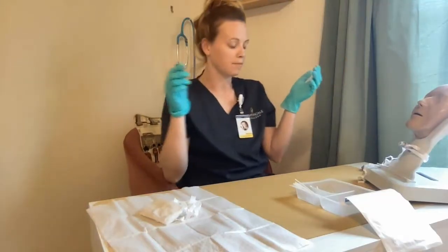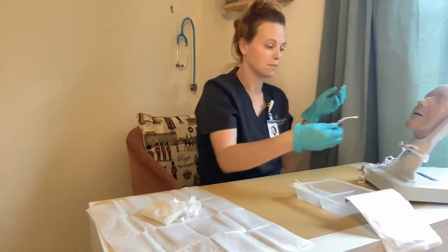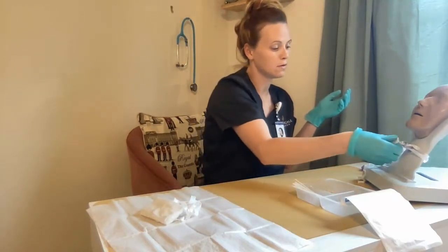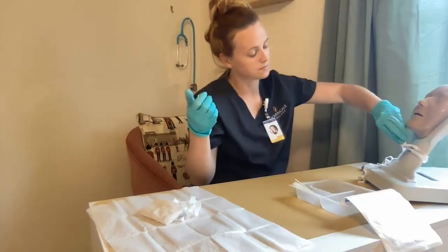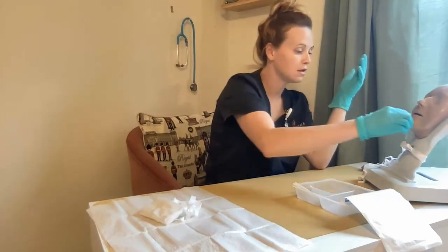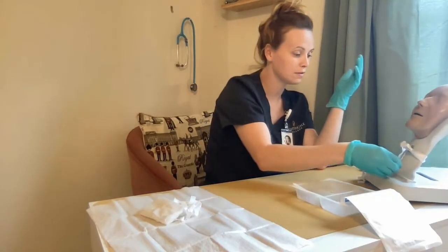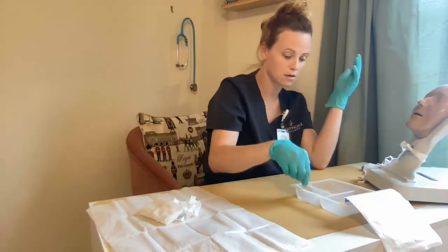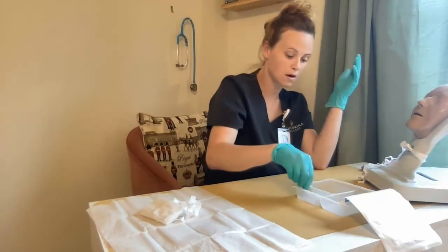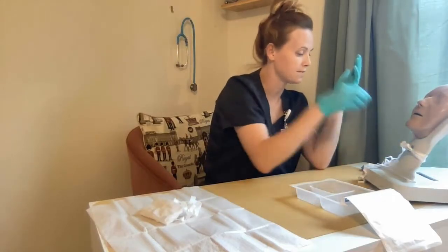I'm then going to get my cotton applicators and place them in the saline on the other side. I want to then place my intercannula back in again, ensuring that it goes in with the same curvature, and lock it in place. Then I'll get my cotton applicators and clean around the stoma, discarding after each use, repeating until the area is clean.